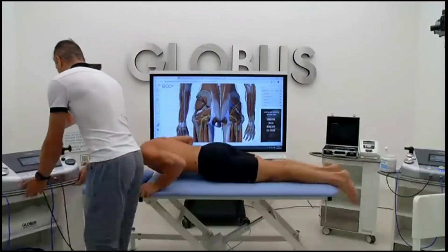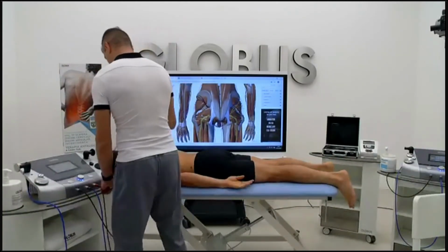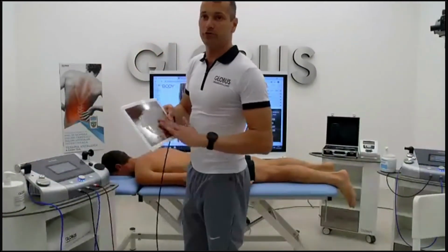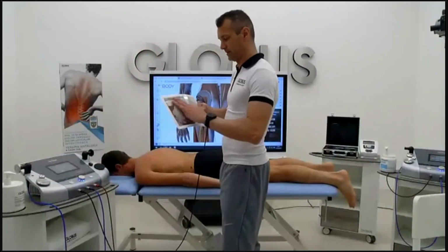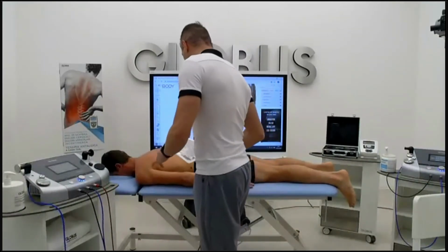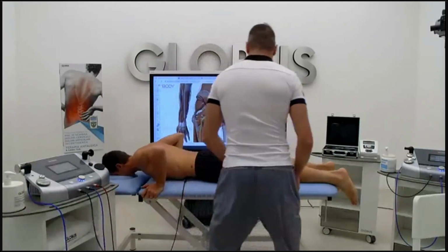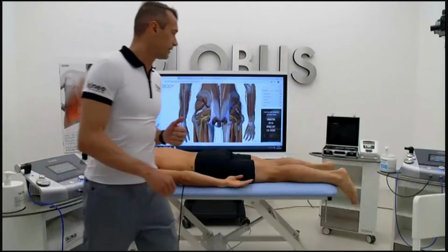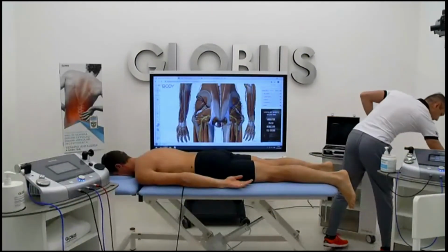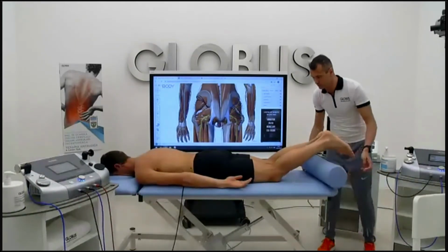We're going to use this device here. We need to put a bit of cream, as you know. We put the plate under the belly. Then we need a cushion. C'era un cuscino rotondo qua dietro. Ok. Alza i piedi, vediamo. Ok, giù.